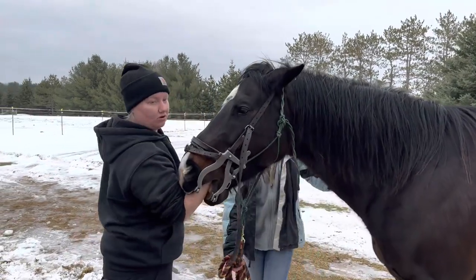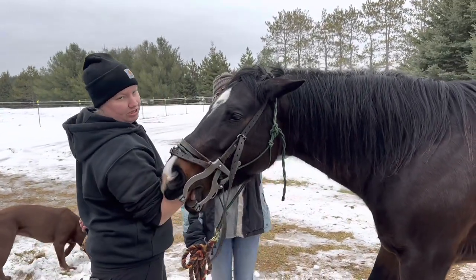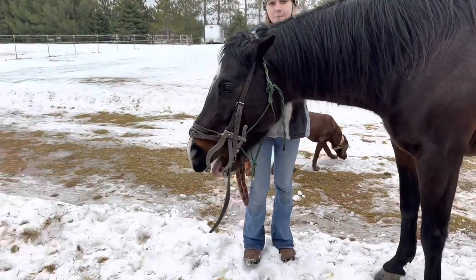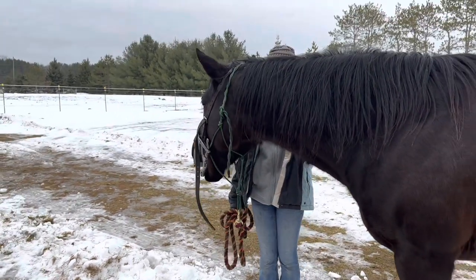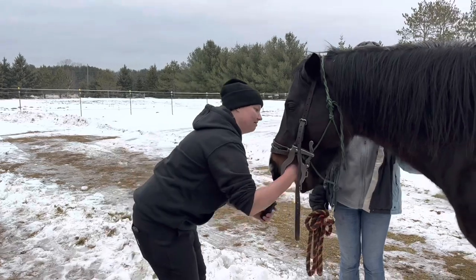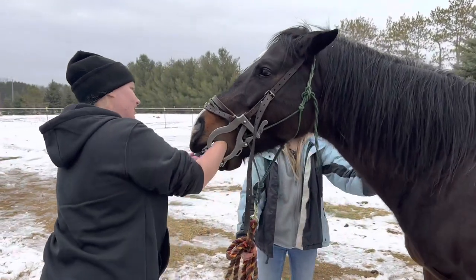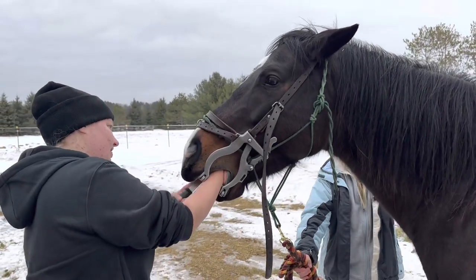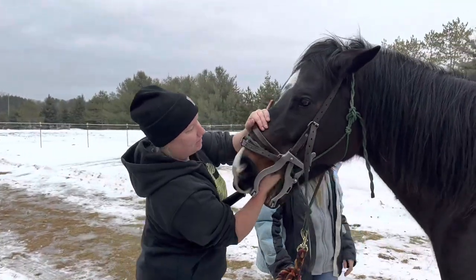Her back teeth are so close to her cheeks, so I'm trying to make sure I really get those points well, because even doing her every 6 months, we just caught her in time. Another month, and they probably would have been cutting into her cheeks. You're doing good so far. Finish your taps right now. Mouth conformation, she's got a really nice mouth.